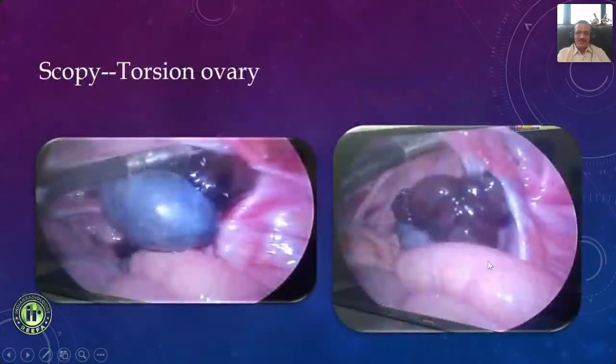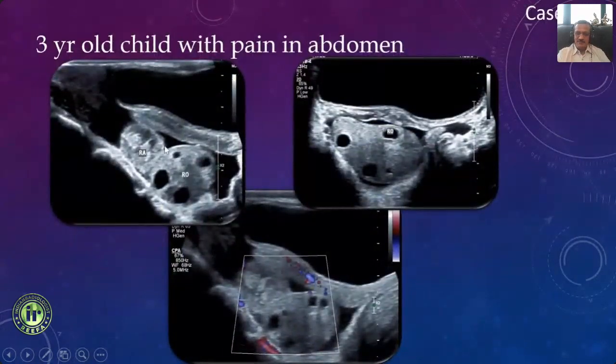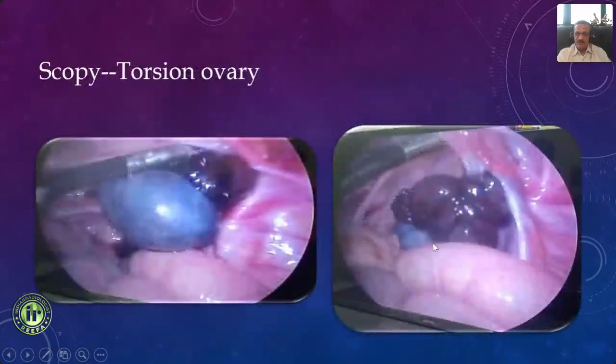So that's an ovarian torsion, and what is important is I think Marlene told us that day that these primordial follicles, which normally we don't see, suddenly become blown up, and this is referred to as a mala sign or pearl sign. And what is very important is this right adnexa. There is a whirlpool there, and this whirlpool showed little flow, but the ovary did not show flow.